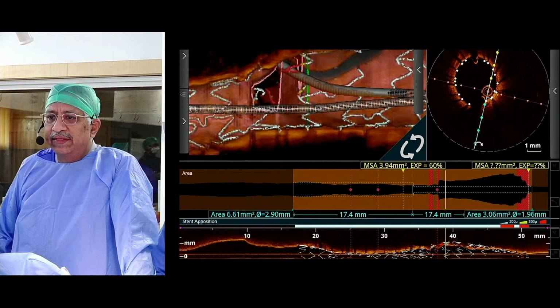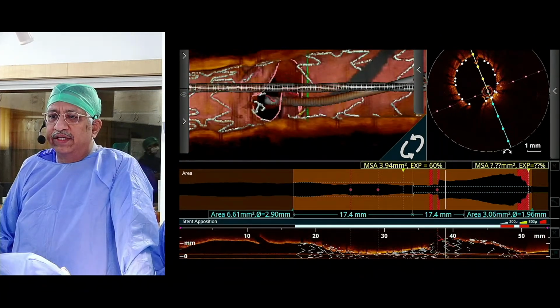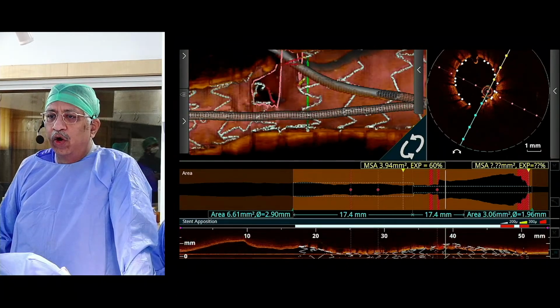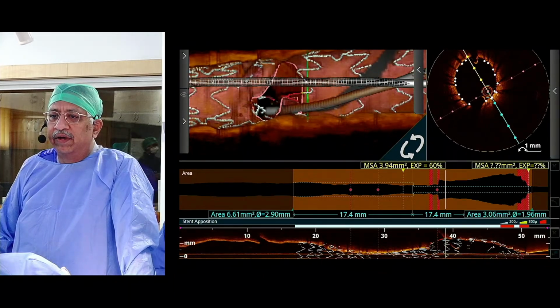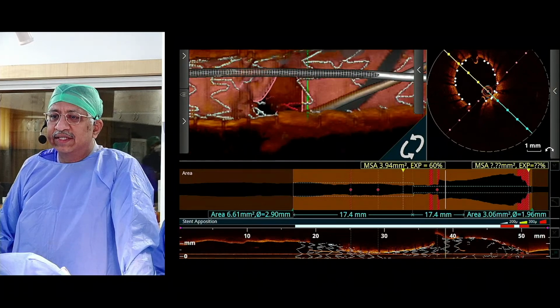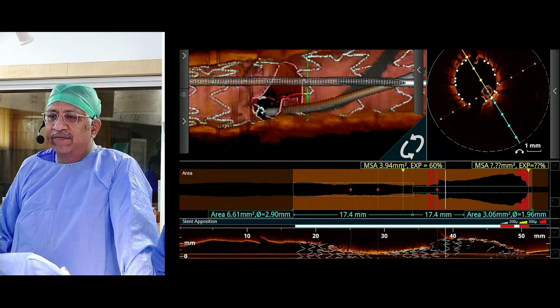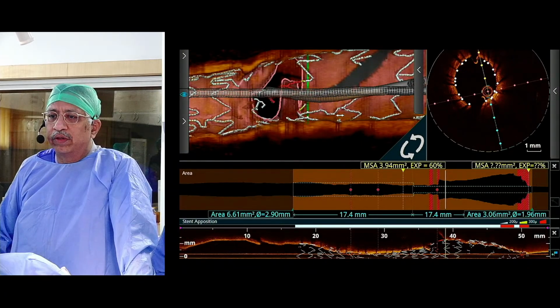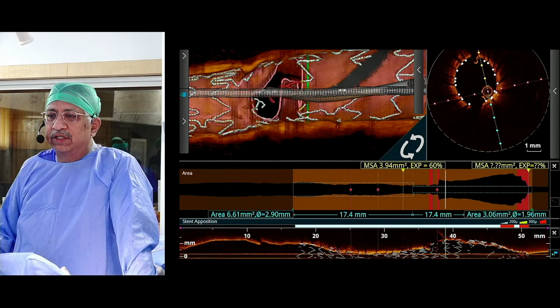You see, there is the lower part, there is a little bit of struts there, but if you look at this wire, the wire has gone distal to that crown there. I hope you can make that out. The wire is in between the crown and the valley, but there is a strut that is a connector across. And this connector across, after some years, there will be neointimal growth at this particular point, and what we normally will find is that this divides the L-circ ostium into two. Can we do a lateral rotation also there, and you'll be able to see this much better.